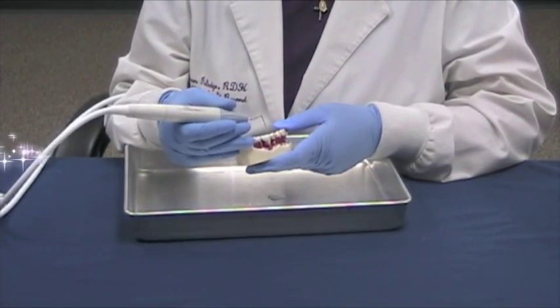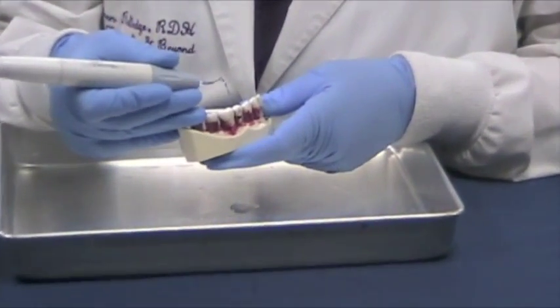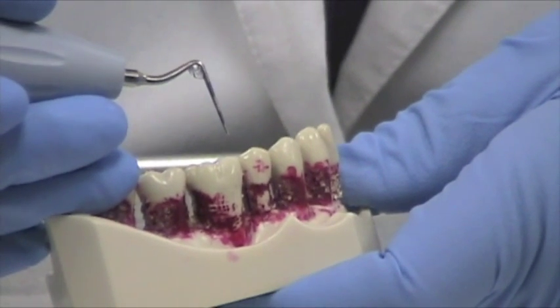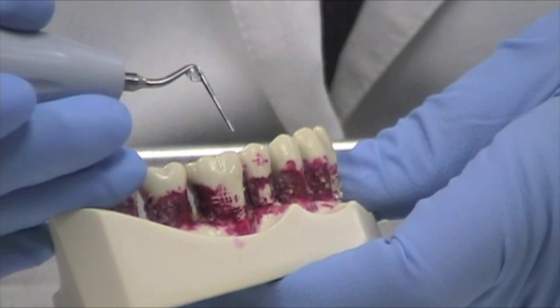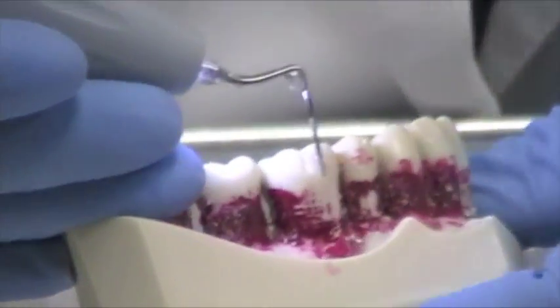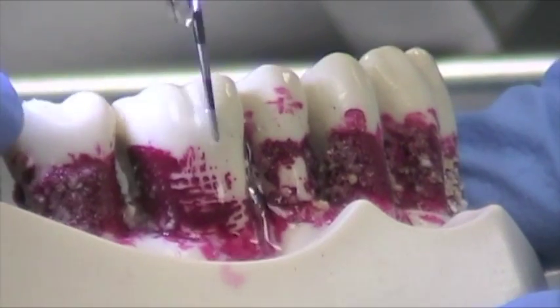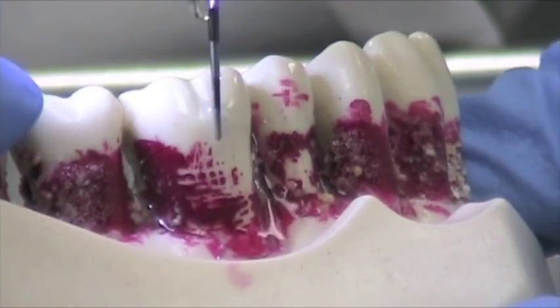We're first going to start out with demonstrating our TK-1-1S tip. I like to call this my short perioprobe, and for all you hygienists out there, you can see why I call it that because it looks like an exact perioprobe. The demarcations are 3, 6, 9, and 12. The tooth I chose here does not have any red or fake calculus because it's for biofilm debridement.